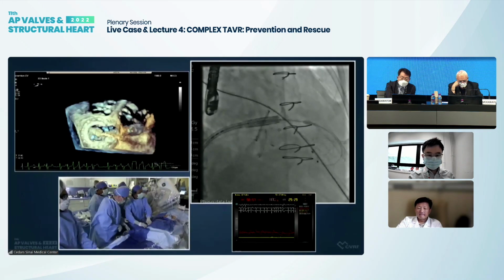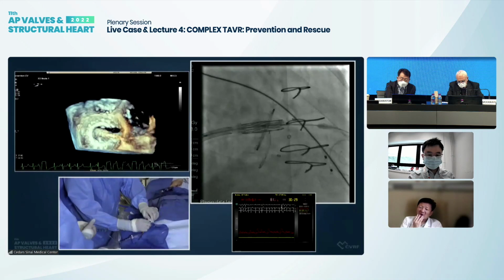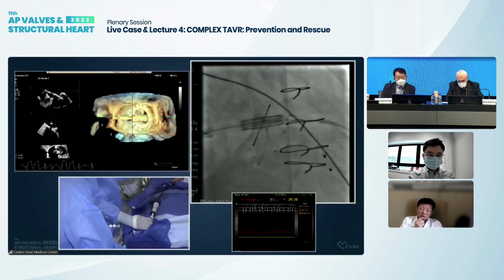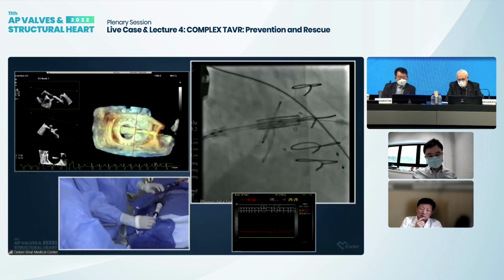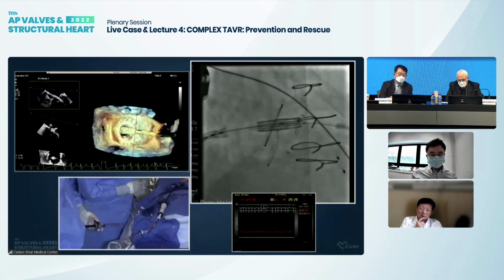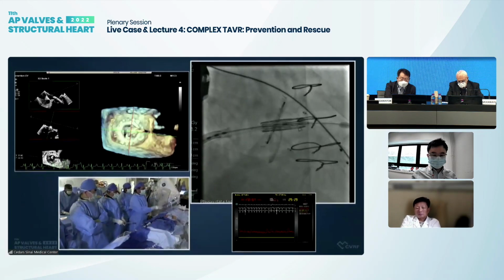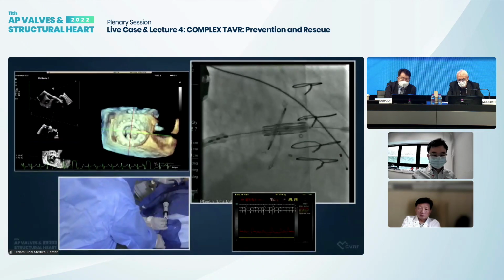As you can see now, the ring, which forms the base of the valve, is like a straight line, and the three posts are all in a straight line. If you use your imagination, this valve is almost rectangular, looking in. That is your view. So our valve is aligned with the lower posts, and as we come up, we should remember to bring this back adequately.